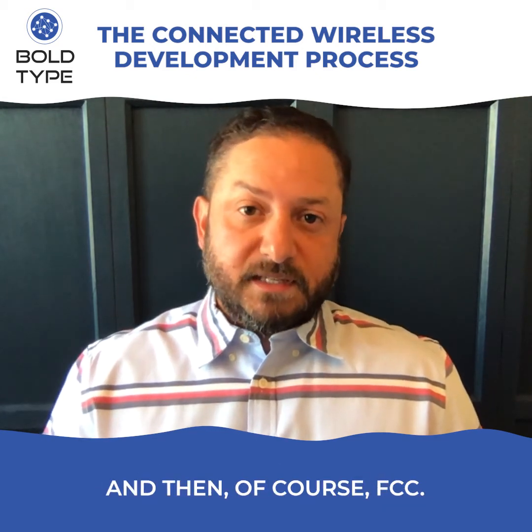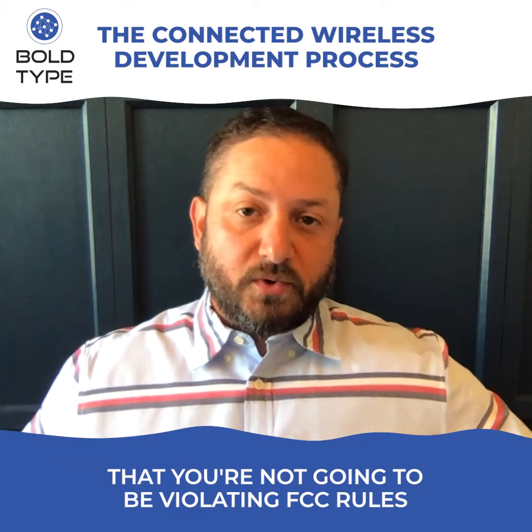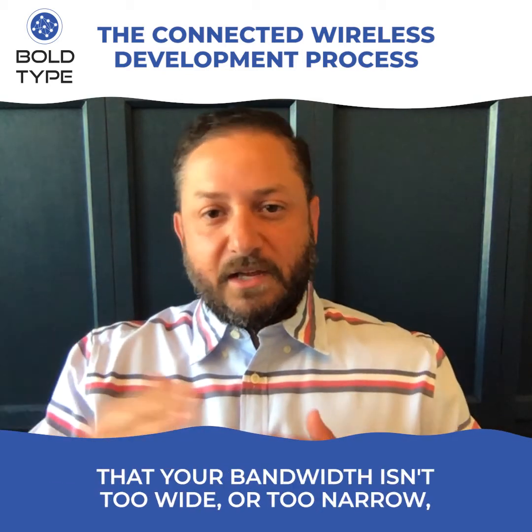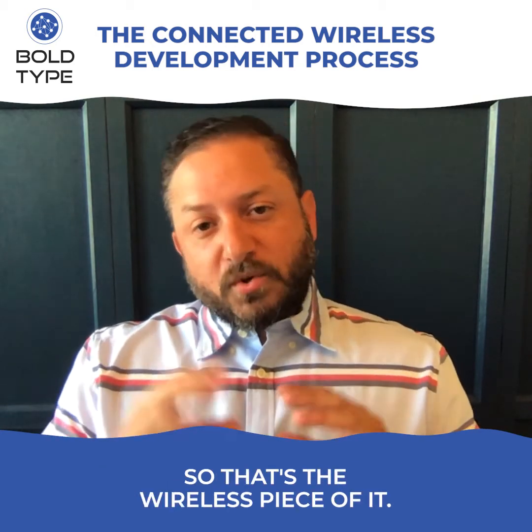And then, of course, FCC. You have to make sure that you're not going to be violating FCC rules that get you in trouble. So you want to make sure that you're not radiating outside of the bands that you're supposed to be in, that your output power isn't too high, that your bandwidth isn't too wide or too narrow, those sorts of things. So that's the wireless piece of it.